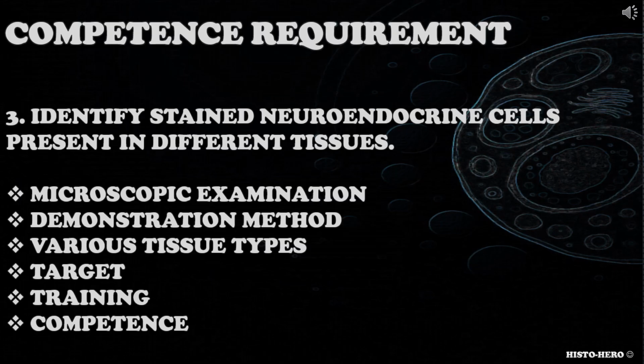When addressing this competence requirement, candidate could consider microscopic examination of stained slides, demonstration method used and the target cells, how the staining would look like on a stained section, their training and competence.